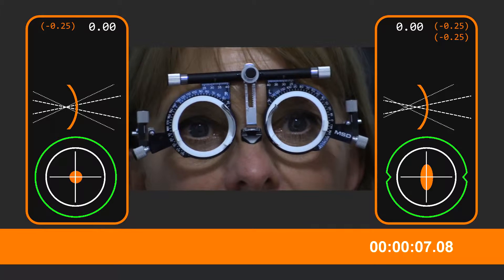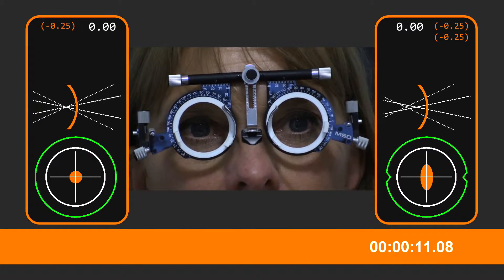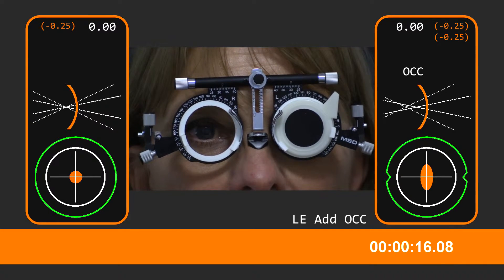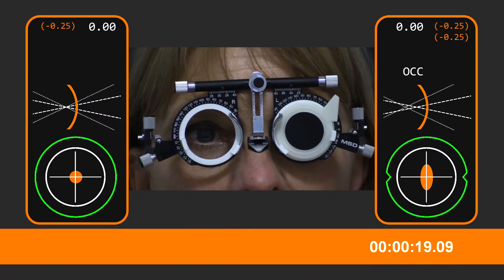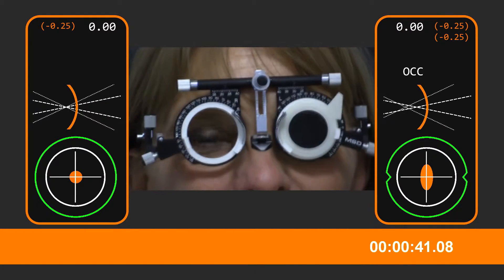Let's just quickly see if I find the blank — I lost it last time. There you go. Can you see any of those letters there? I can indeed. Read them for me. D, F, N, Z. Are they background? F, O, T, L, A. Oh, you're reading them the other way! Reading the other way, madam. I was thinking they were actually in reverse because you're used to it — I'm used to doing it like the patient.